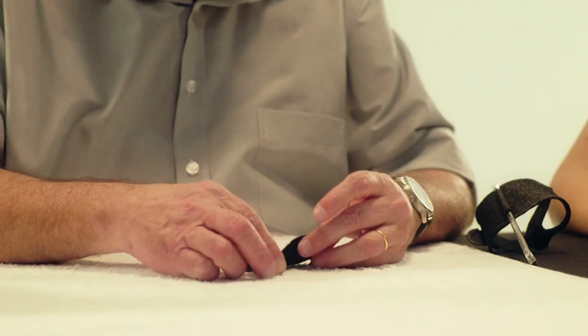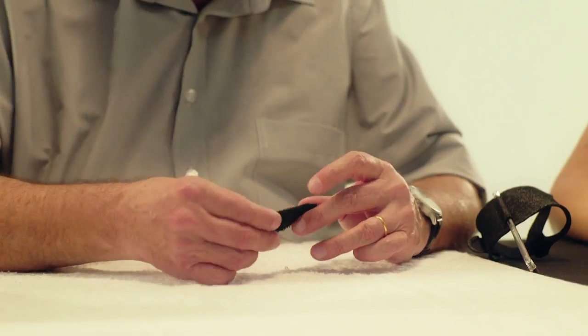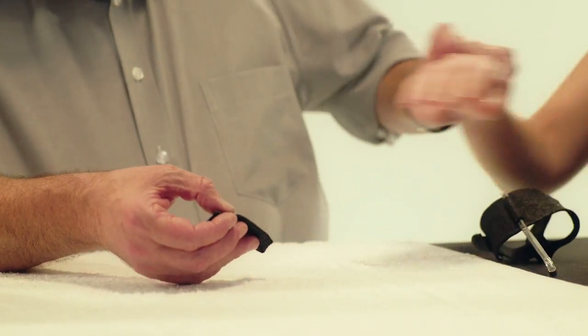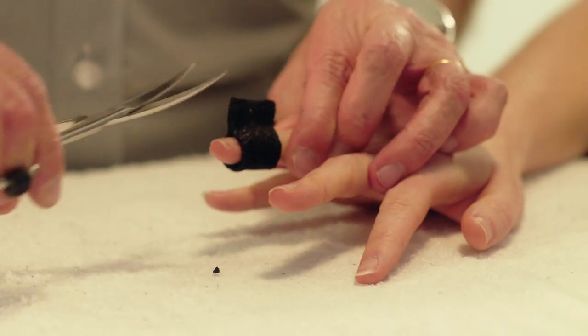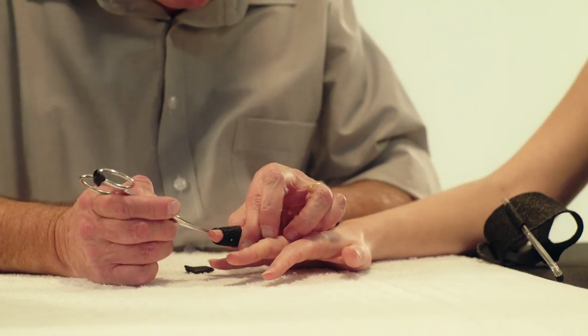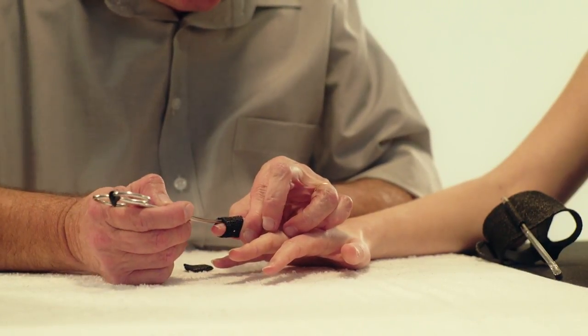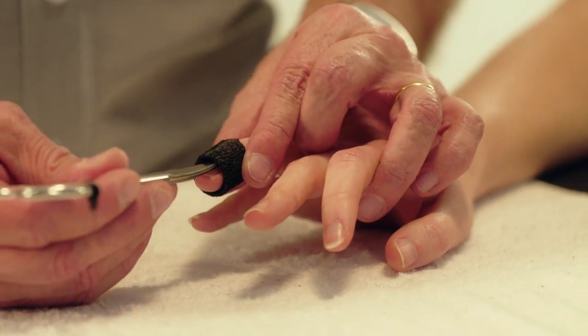Take a small band of OrphiCast, heat it and fold it double lengthwise. Wrap the OrphiCast around the DIP joint and cut the excess material. Take the curved scissors and slide them underneath the finger cap while it hardens to ease donning and doffing of the finger cap.